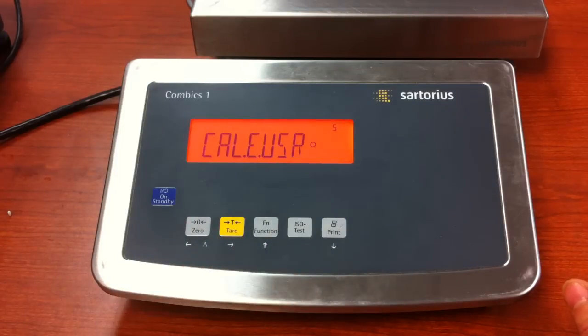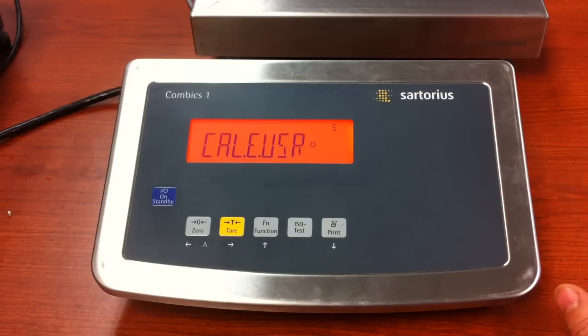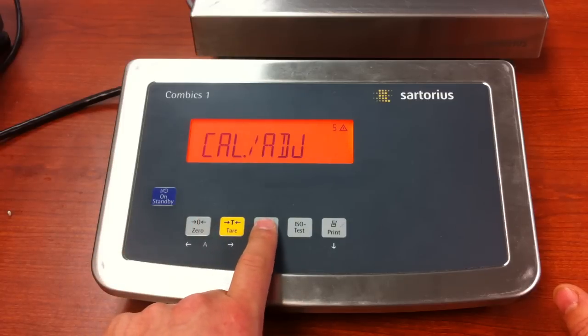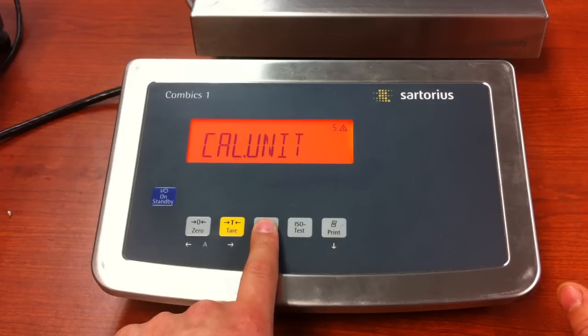So we have the circle. If you do not have the circle there, you would press and release the tear key. Then press and release the zero key to go back one level to cal adjust. Now go back to pressing and releasing the function key. You're going to pass cal.ext. You're going to pass cal unit, unless, of course, you needed to change it from kg to pounds.